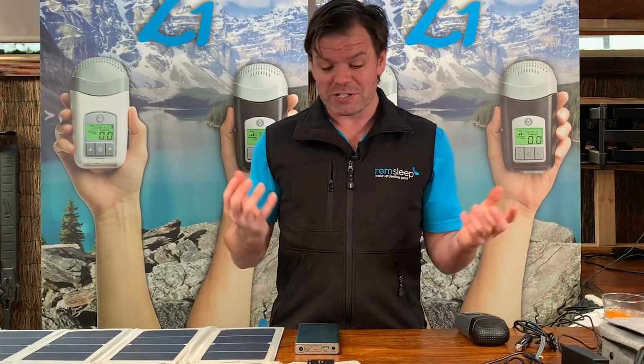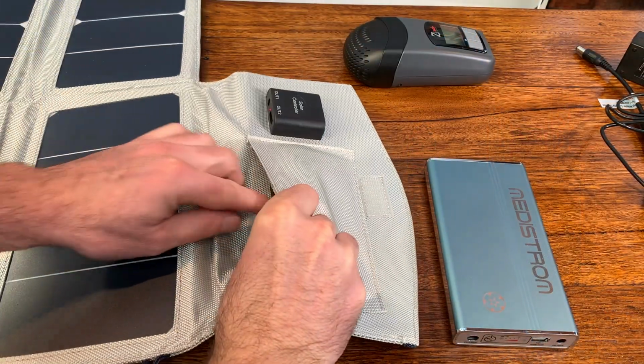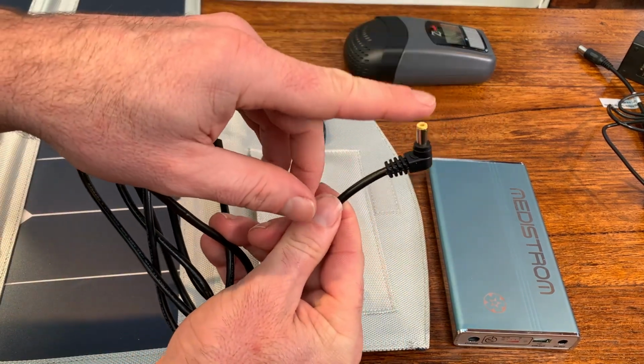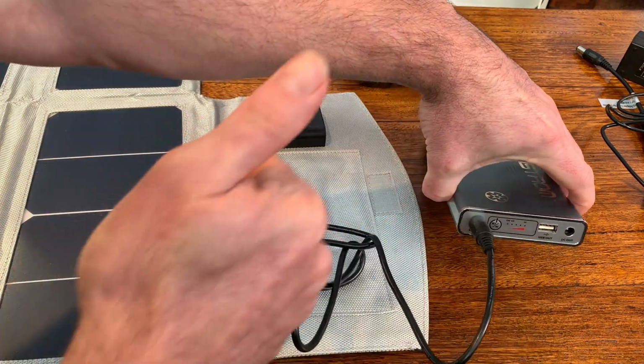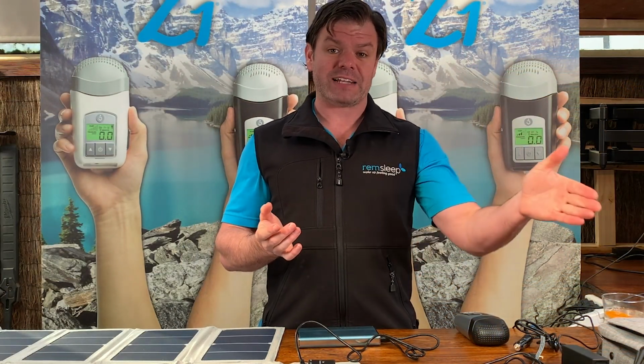Moving on to the solar. So the solar has a little pouch in it here, another charging cable, and the yellow end just goes in a little out on the solar controller, and then into the charge port again. And you just put that out in the sun, and it's gonna take somewhere between 10 to 12 hours, depending on the sunlight, from flat to full.